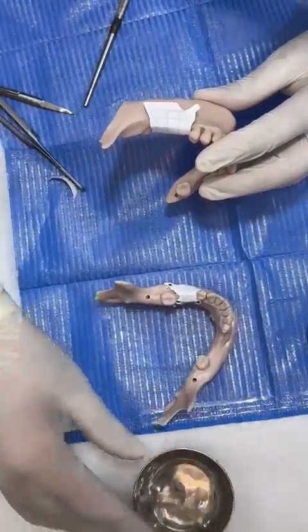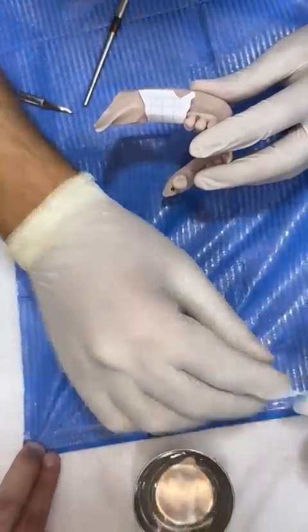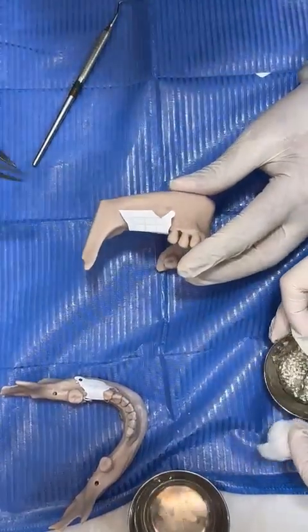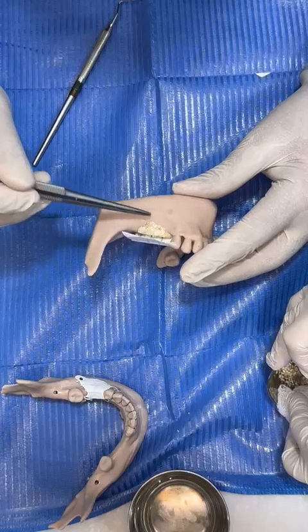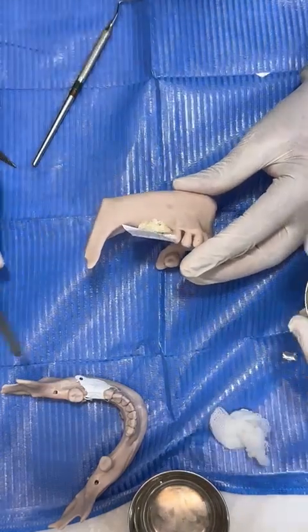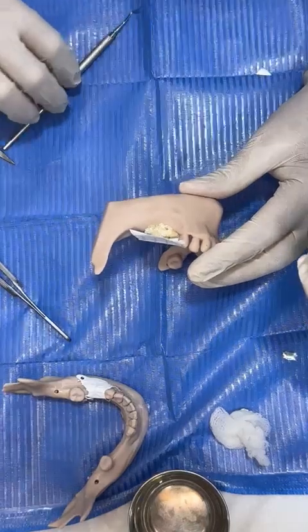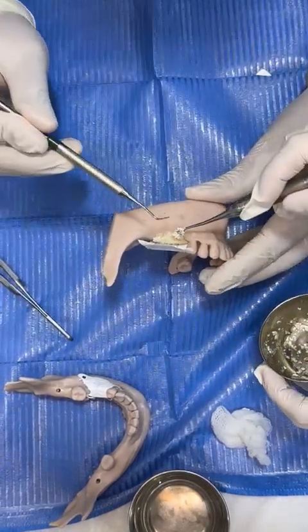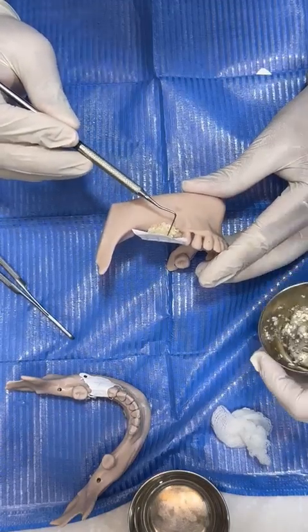Okay, then you have the mix and the gauze. This is the situation now. Give me graft. Thank you so much. More, put more amounts.